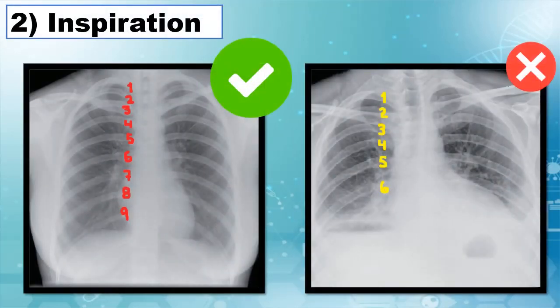Then we will focus on the inspiration. If our x-ray was taken with a patient exhaling or not inhaling enough, the organs within the chest will be compressed and we might get a false perception of them. In order to certify a good inspiration, we should always see 9 or 10 posterior ribs attaching to the vertebrae. Here we can see a case with poor inspiration that might, to a novice student, give the impression of being a cardiomegaly — which is not true, it just lacks enough inspiration.